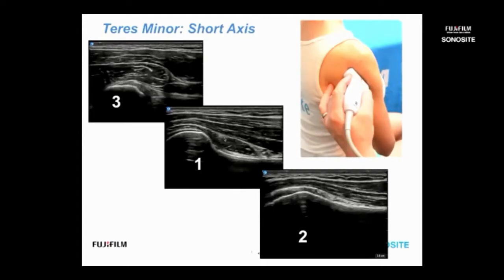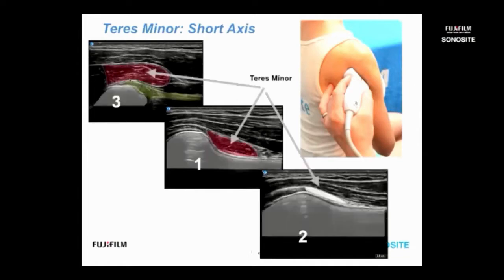Here we have the deltoid overlying this, and then up here is the infraspinatus, most inferior margin. And then from there, you just want to translate the entire transducer either towards the scapula, where you'll catch the inferior margin of the glenoid here, and then come back to your home base of the humeral head-neck junction posteriorly, and then slide laterally to catch that inferior facet. So here we are at the enthesis of the teres minor, and highlighted I've got the distal muscle belly of the teres minor here at our landmark centrally, and then the tendon of the teres minor, most distal and lateral.